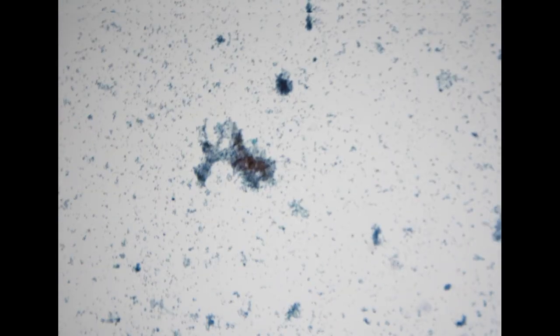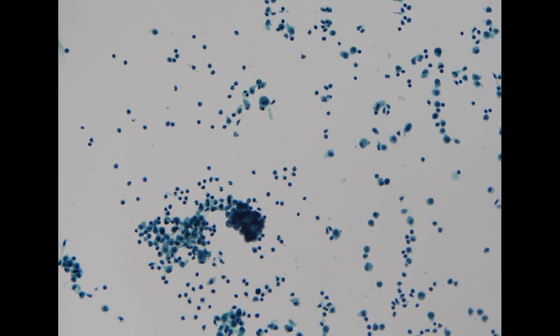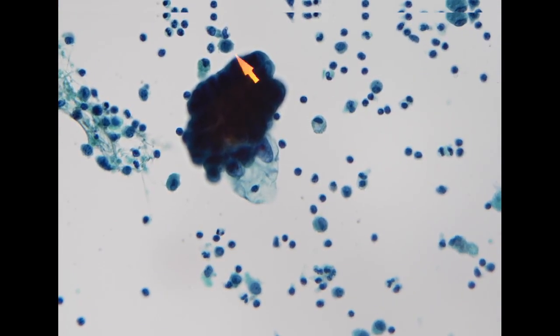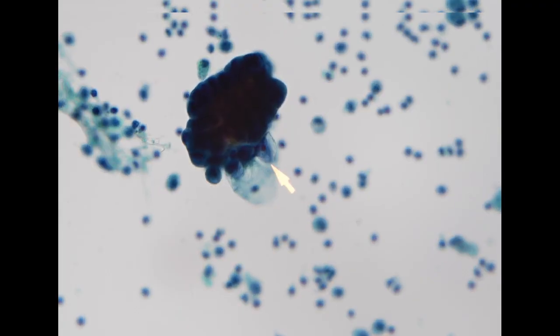So in the background, we see a lot of inflammatory cells and relatively scant cellular clusters. For this specimen, we only have a few clusters of cells showing striking nuclear atypia. Despite the scant clusters, I think this is definitely adenocarcinoma.